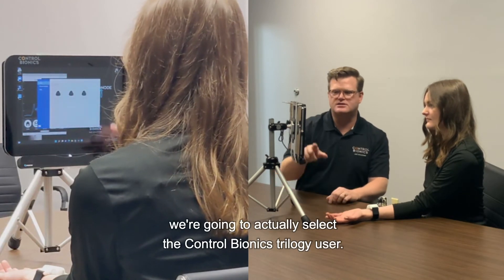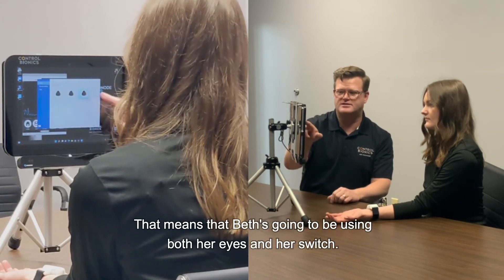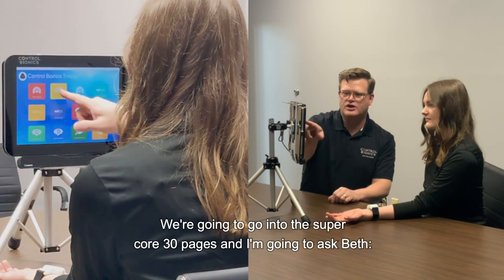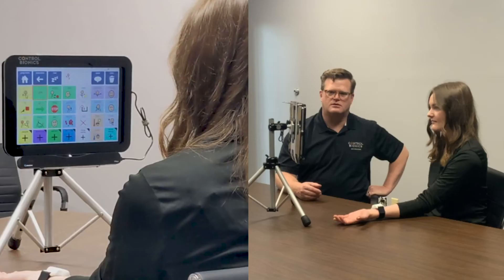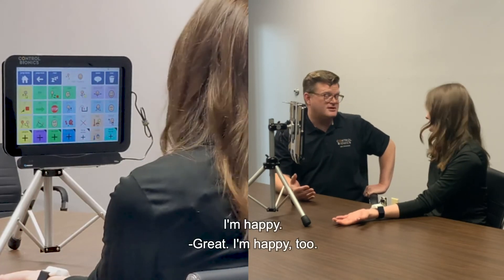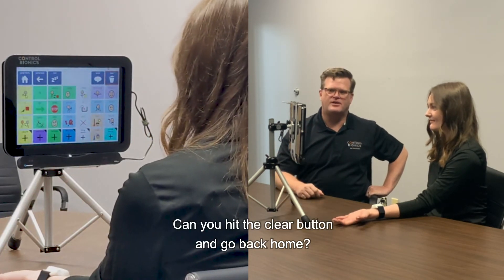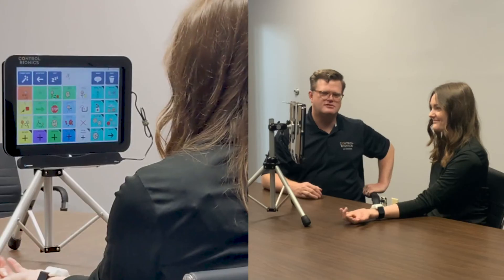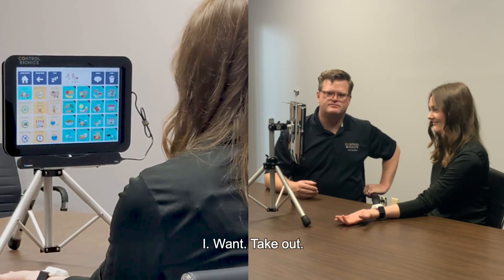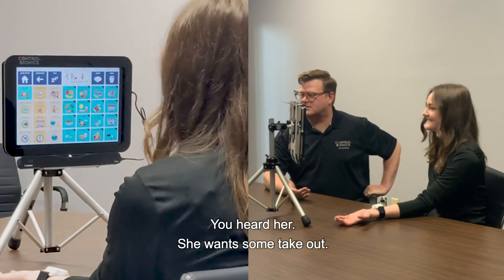So now we're actually ready to go into the speech software. Let's go into Grid 3. Once we're in Grid 3, we're going to select the Control Bionics Trilogy user, meaning that Beth is going to be using both her eyes and her switch. We're going to go into the Super Core 30 pages. Hey Beth, how are you feeling today? Great. I'm happy too. Can you hit the clear button and go back home? What do you want for lunch? I want takeout. You heard her — she wants some takeout.